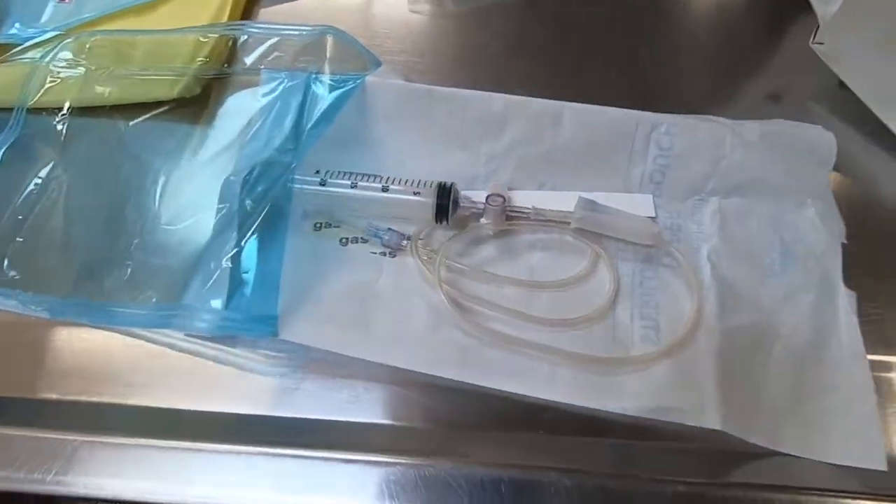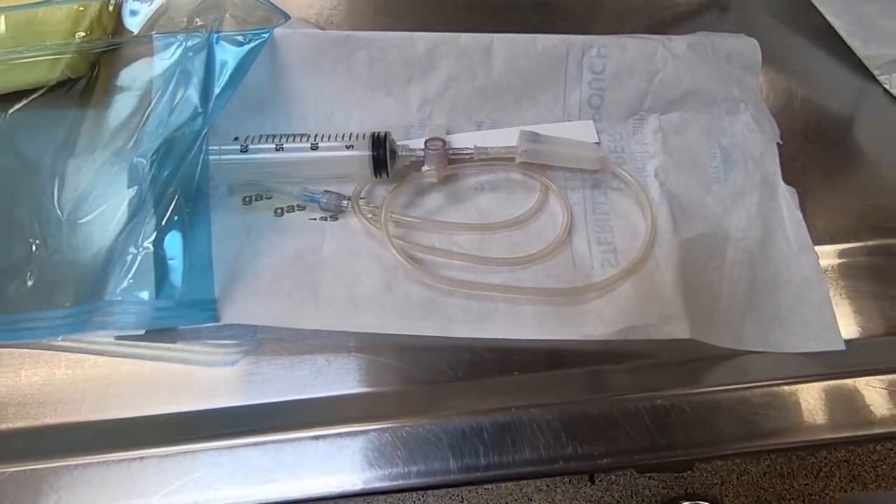Generally, it's going to be a syringe, and I like smaller syringes — 12 mils, maybe for a big dog 20 mils, but nothing bigger than that. They're just too hard to handle with your hands.